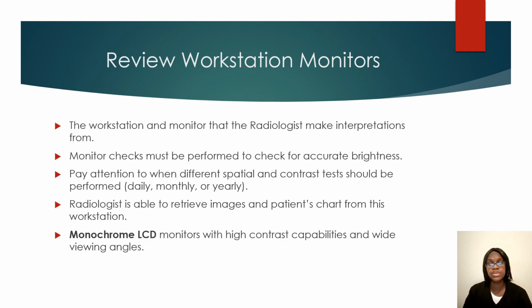Whenever you are reviewing your workstation monitors, the radiologist monitor is going to be the one that makes the interpretation. The radiologist cannot interpret or make a diagnosis based off of the technologist workstation. They have a better monitor and they can see better. So we just use ours to take the images, check for motion, annotate if we need to, zoom in, zoom out, and their monitor is best for making diagnosis.